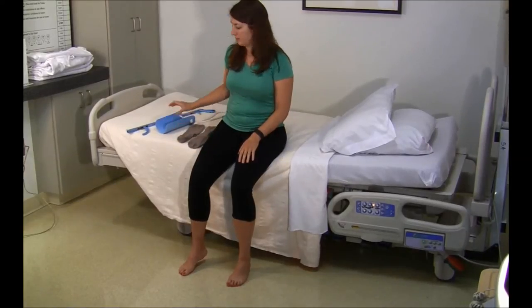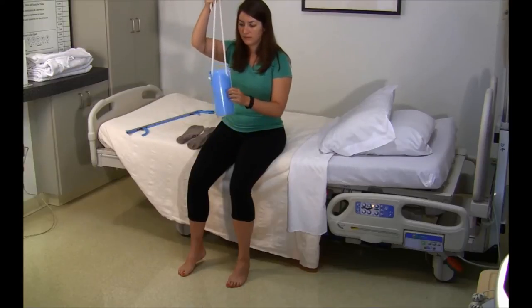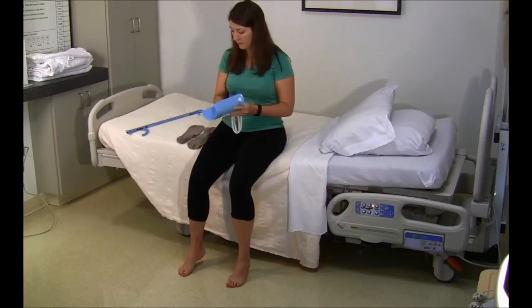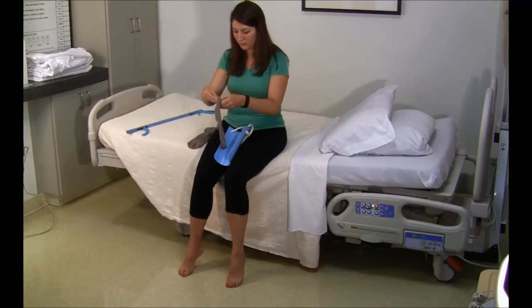A stocking aid is a piece of adaptive equipment that is used to help put on a pair of socks by yourself. A stocking aid is mandatory if you are a hip replacement patient, however, it may be beneficial for knee replacement patients as well. To use the stocking aid, first you will need to place the sock onto it.